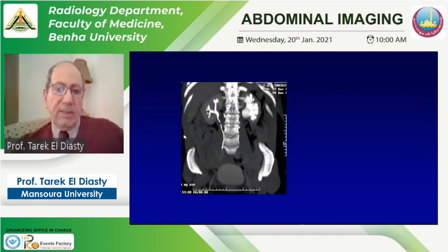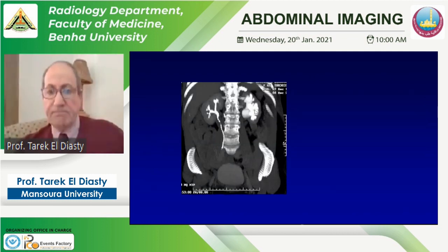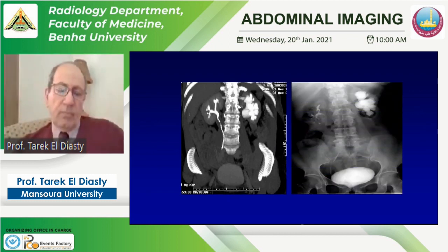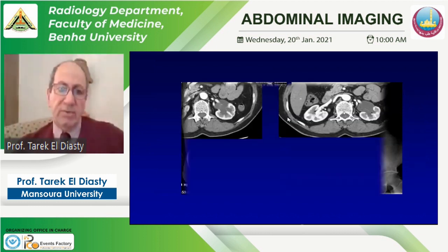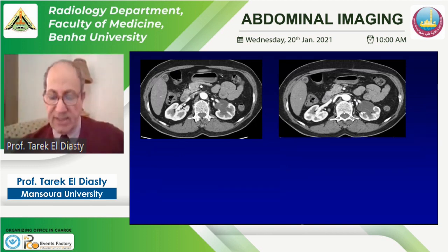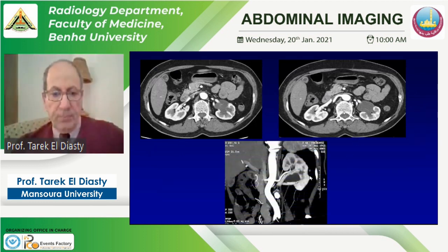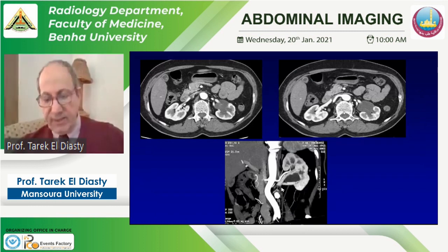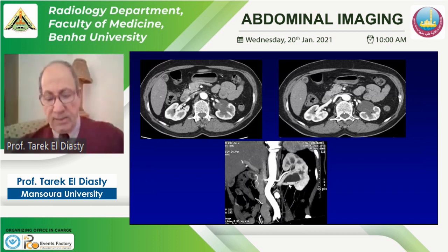In a case of left ureteropelvic junction obstruction on CT urography — similar findings to IVU — CT adds value by assessing for a crossing vessel at the UPJ. Here, a crossing vein at the ureteropelvic junction is identified. This affects management: if a crossing vessel is present, the patient should be managed by open pyeloplasty rather than endoscopic pyeloplasty.